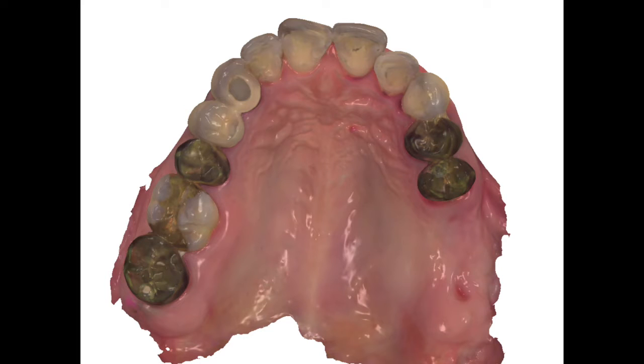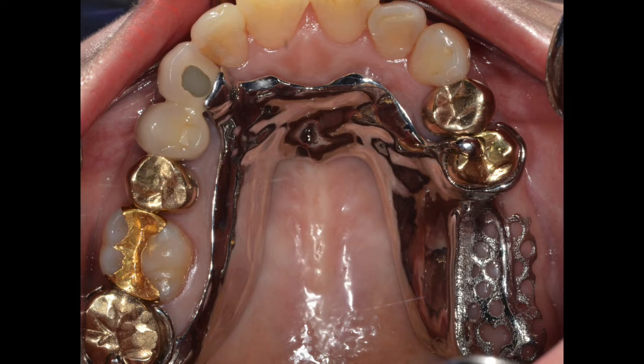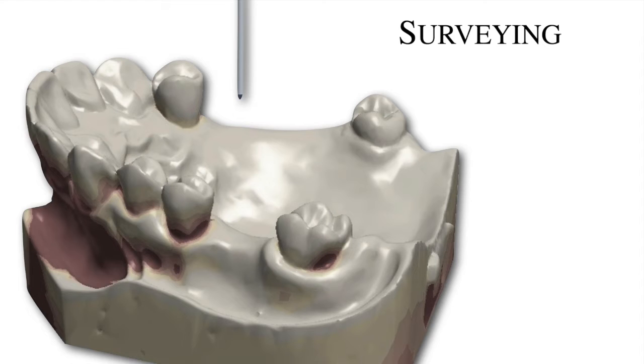As you notice, the maxillary partial denture does have a metal framework. When the patient has a partially edentulous condition, we plan to design a metal framework which provides the support, stability, and function of the removable partial denture. And this is when the metal framework is placed intraorally. And surveying is the tool, the analysis, before we fabricate the metal framework. So, surveying is the analysis and comparison of the prominence of intraoral contours associated with the fabrication of a prosthesis.